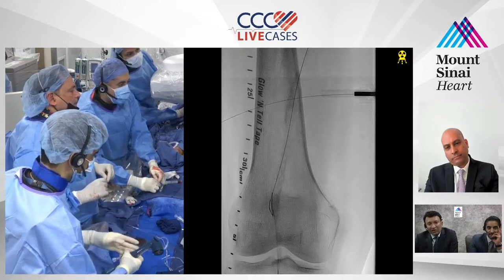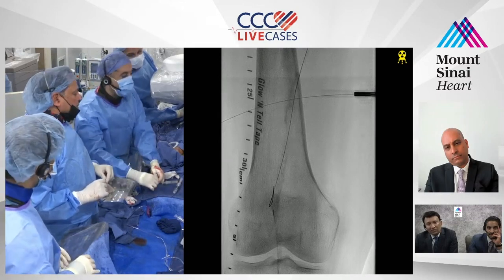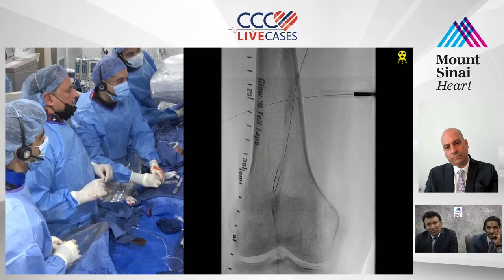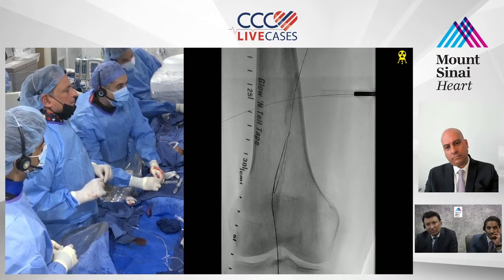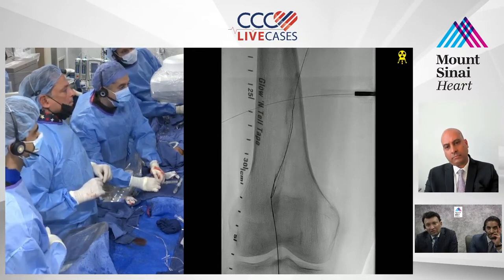No, but I don't like it. It's too much resistance. Yeah, that looks like it might be. I think you already made that bend. I think you're in, you just have to get the catheter. You can push a little bit more. Lose the loop here. I know, but there's probably a kink up there. You can push a little bit more, PK, Vishal. I think once you go through that bend, you'll lose the loop by yourself. What I'm trying to say is there's a possible kink up there with the entry point.